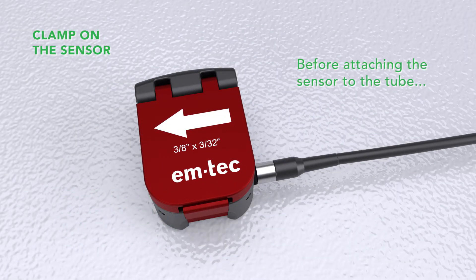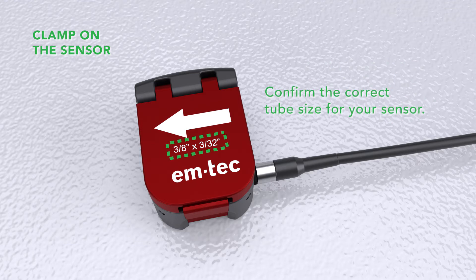Before you attach the sensor to the tube, refer to the flow direction and confirm that the tube you're using is the one the sensor was adjusted and calibrated for.